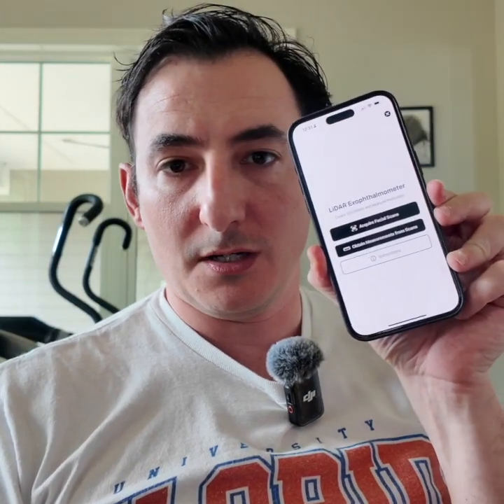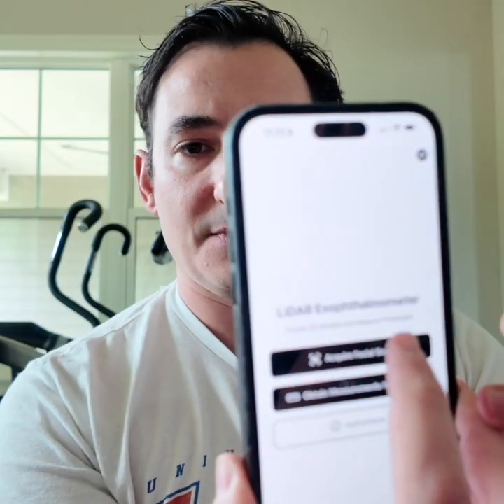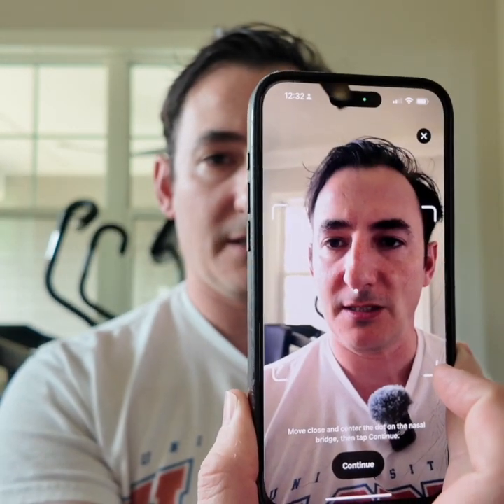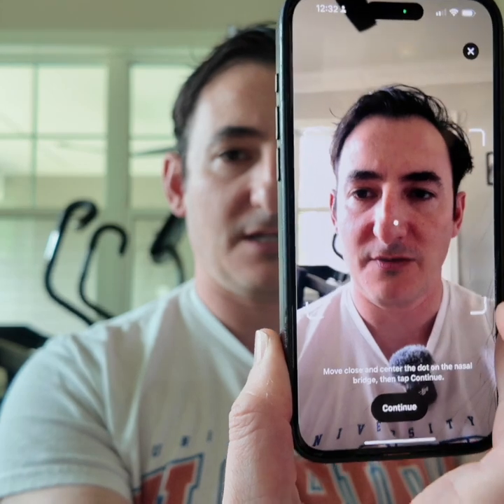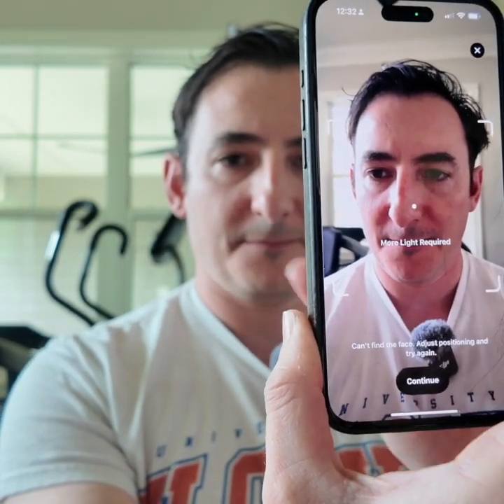Hi guys, I want to show you the new LiDAR Exophthalmometer in the My Call Bag app. Tap 'Acquire Scan' and then follow the prompts. It should say to put the eye in focus, put the dot on the face, and then you hit this button here to start.